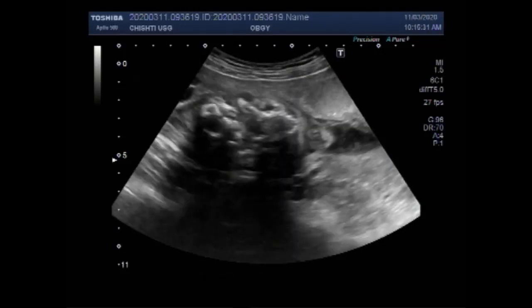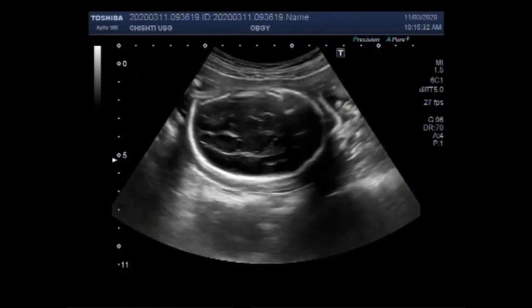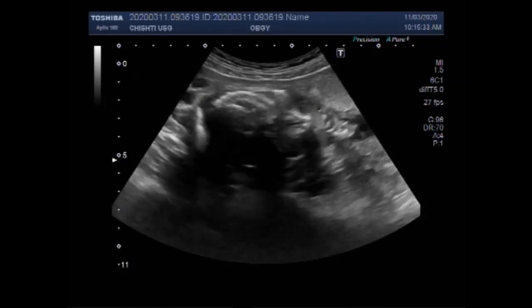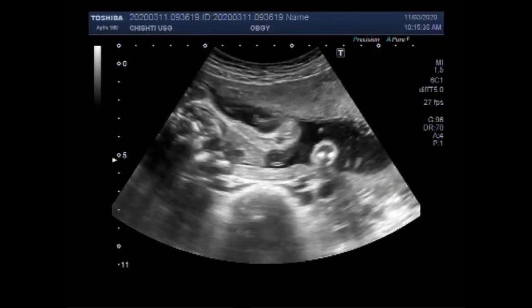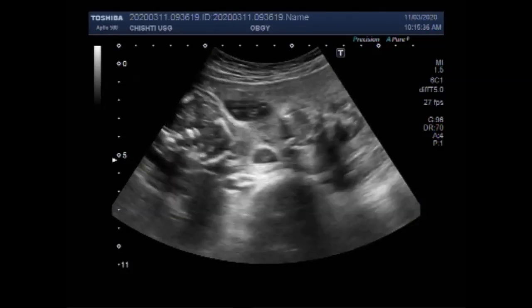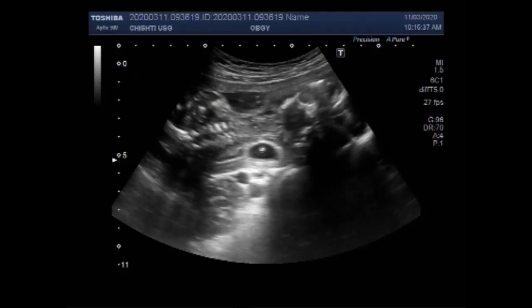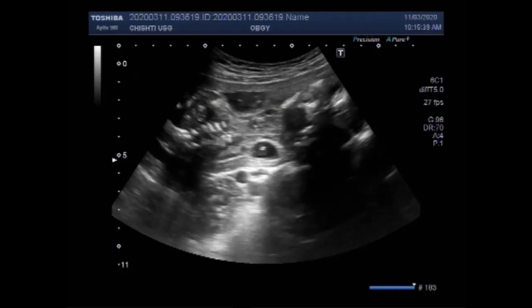The Spalding sign refers to the overlapping of the skull bones caused by the collapse of the fetal brain. It appears usually a week or more after fetal death in utero. Most investigators accept two centimeters or more of overlapping as a positive Spalding sign.